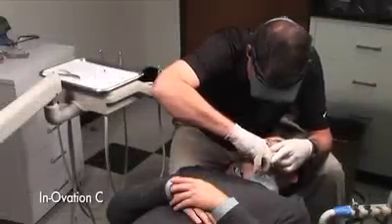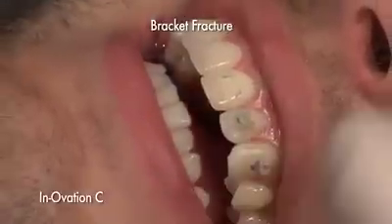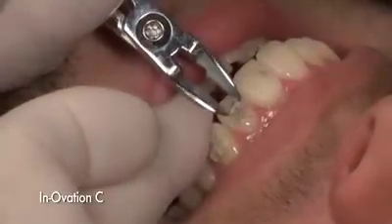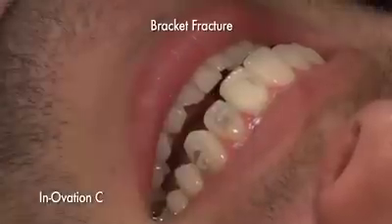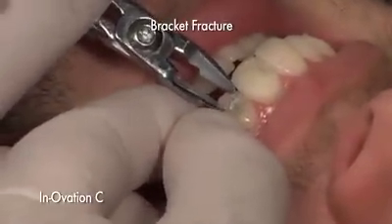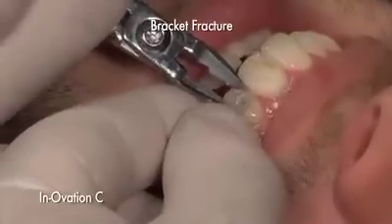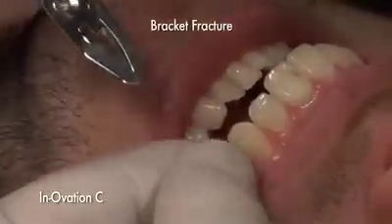Not only did it take three times longer to debond Innovation C brackets, but Innovation C was found to be more susceptible to bracket fractures. On this patient, all three Innovation C brackets fractured during debonding. The base of the bracket is fractured and continuing to crumble. To completely remove the fractured bracket, a diamond burr was required.